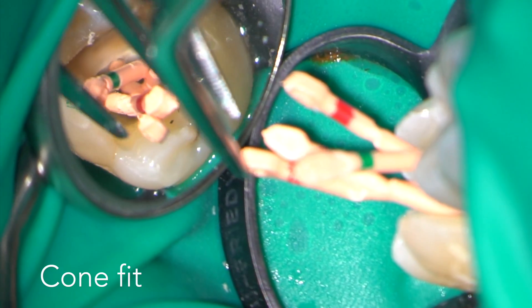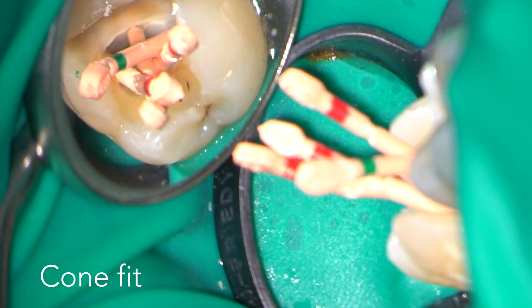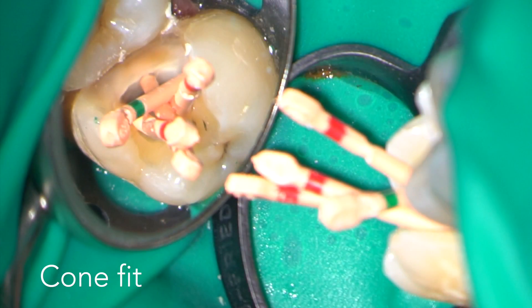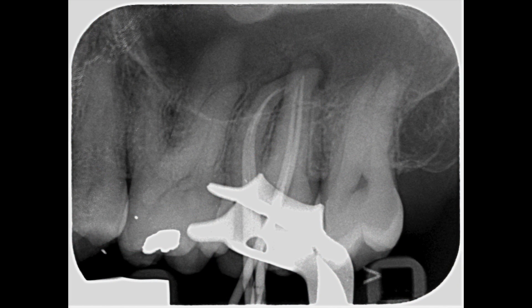I'm now checking the lengths of the prepared root canals by taking a cone fit radiograph. You can see that the cones haven't gone quite to length, so I'm going to go back in with my size 10 hand file as a patency file with copious 3% sodium hypochlorite irrigation. I would also use the finishing file one more time just to make sure that everything was prepared to the correct length.